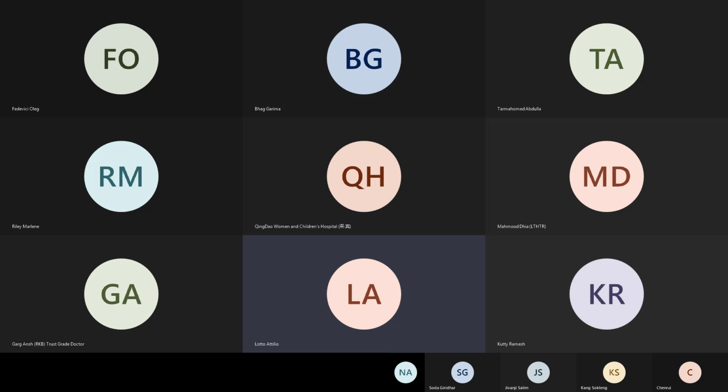That is where I have closed the zone of opposition between the superior and inferior bridging leaflet with an additional patch to enlarge that area. And if there is a papillary muscle, just split it a little bit and thin down the subvalvular apparatus, because sometimes the stenosis is really at the level of the subvalvular apparatus and puts a lot of stress onto your repair.